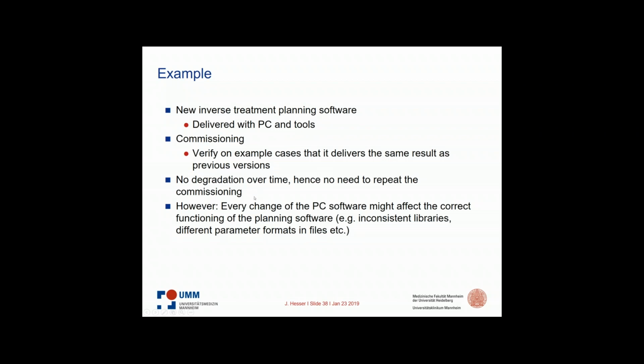However, whenever you change something slightly, operating system, libraries, whatever, the software has been tested on a certain environment and verified to work correctly. If you change the environment, that's not a guarantee. There might be a reason why it might not work, so we have to repeat that whenever some of these changes occur, to guarantee that there was no conflict.